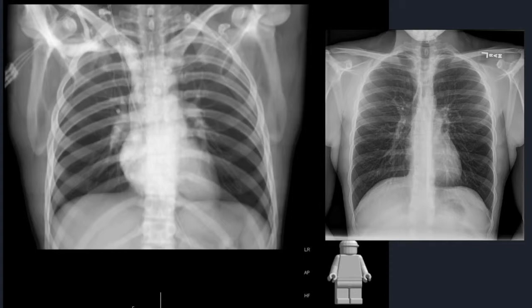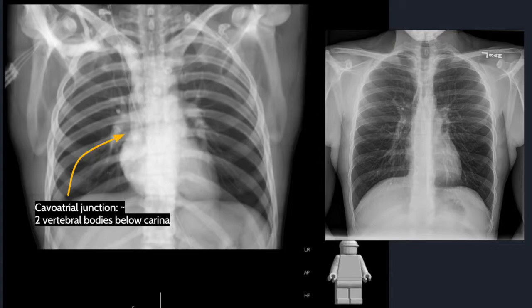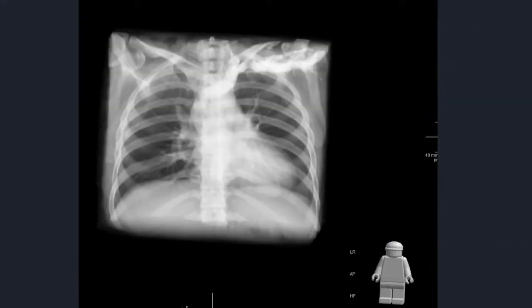A normal radiograph is on the right for comparison. Notice the little Lego man in the corner to show you the position of the image. In this radiograph, notice the right subclavian vein, brachiocephalic vein, superior vena cava, cavoatrial junction, and the right heart. The cavoatrial junction is one of the most important landmarks, and one of the most reliable locations will be approximately two vertebral bodies below the carina. Here is another virtual radiograph from a CT chest with contrast injected from the left, showing the left subclavian, internal jugular, brachiocephalic vein, and SVC. If you understand the basic concepts of these radiographs, you can use your anatomy knowledge with the fact that this is a projectional image to localize any pathology or lines and tubes.